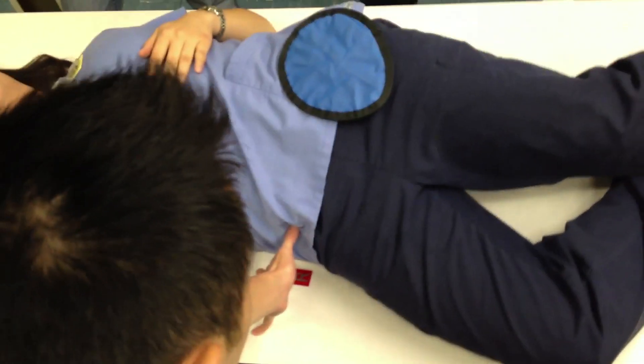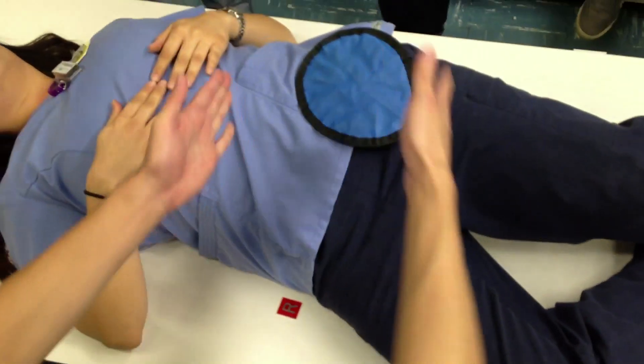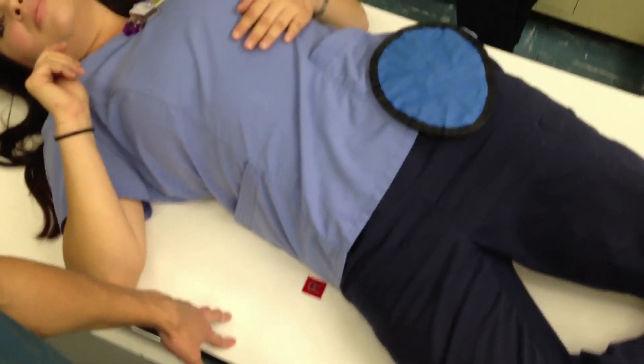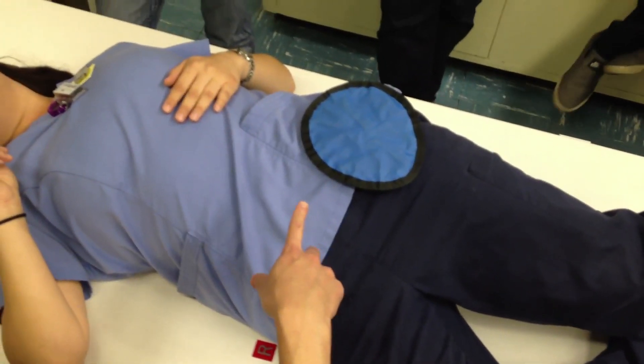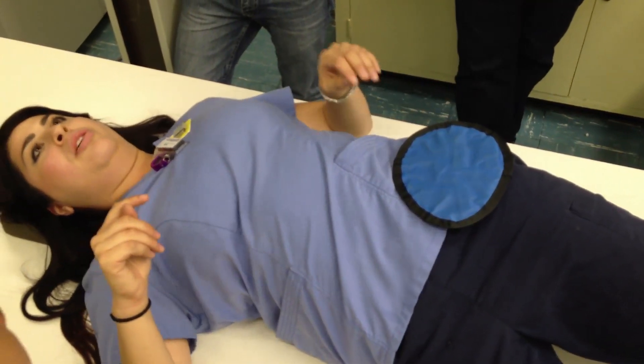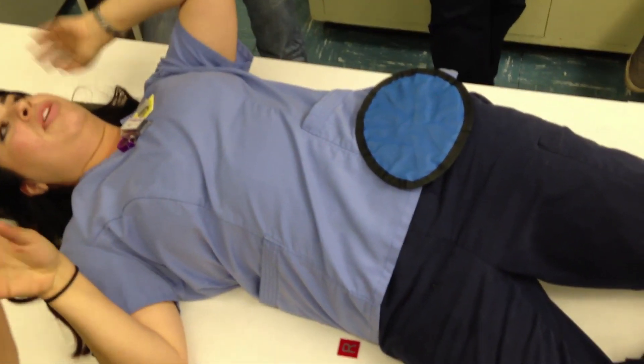Then I'm going to have you rotate towards me a little bit. Patients are going to be in pain regardless — just smile through it. Same positioning, ASIS at the top of the cassette, make sure it's crosswise. You can put your marker right there. Make sure your shield doesn't fall in. Tape is your friend — always carry tape with you, because the patient moves or the shield shifts.